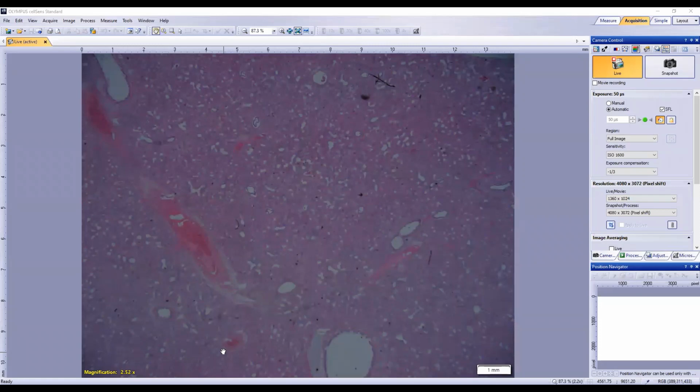Then how many layers of these epithelial cells are constructing the alveolar lining. It could be one single layer, which is perfectly normal, but if it gets more than one, that is absolutely abnormal. It can be multiple layers.